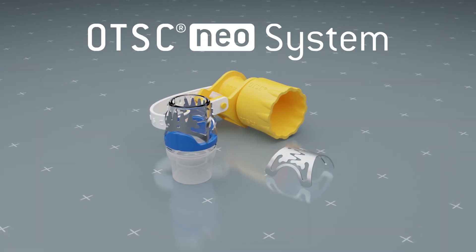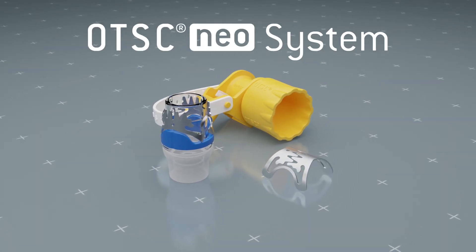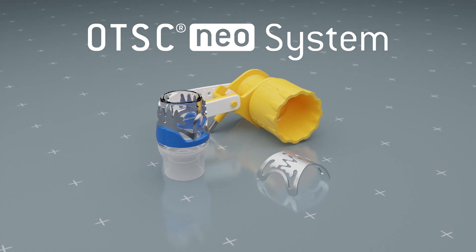The OTSC Neo system set is an instrument for flexible endoscopy for the treatment of lesions in the gastrointestinal tract.